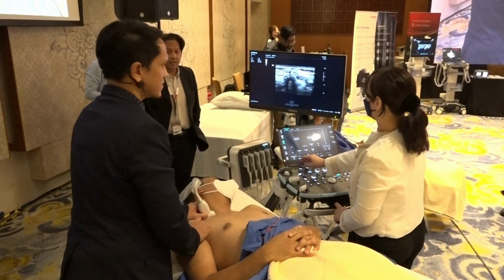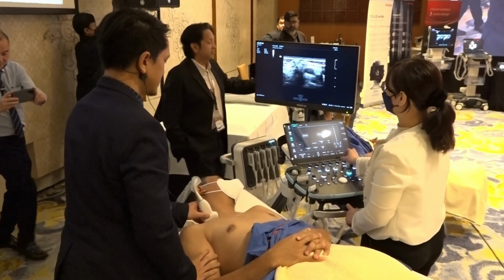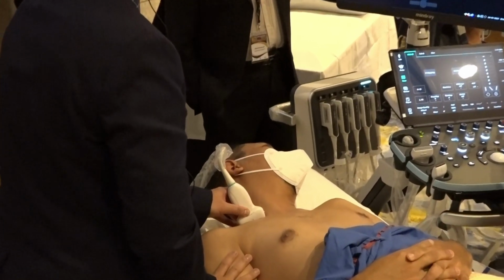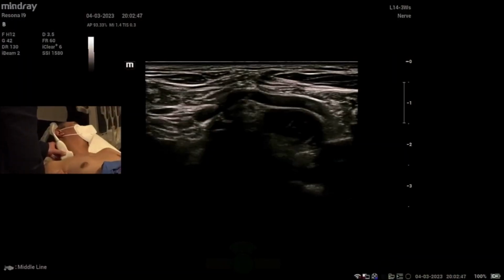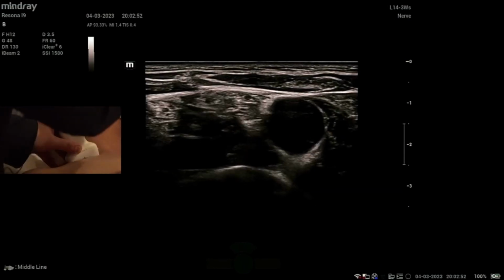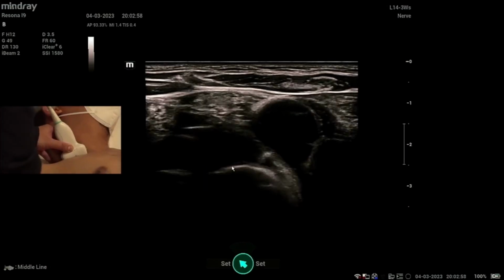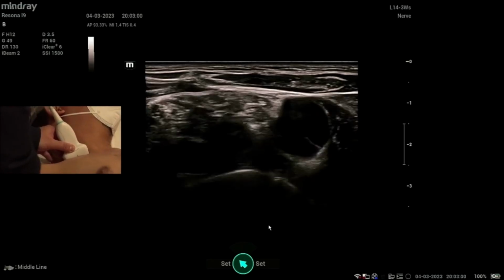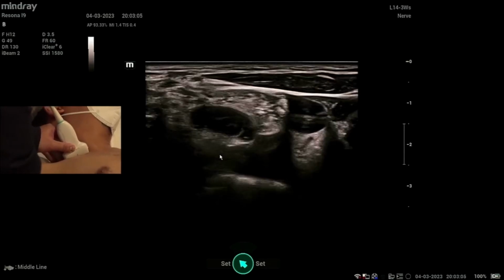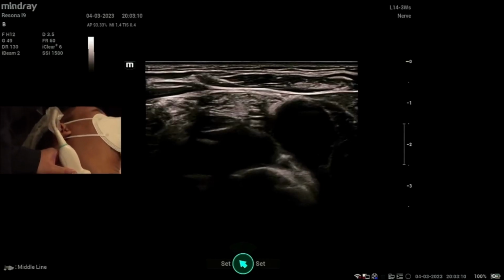Okay, I think everyone can hear me, right? So we're just going to show the basic blocks we already saw just now. The left side of the screen is lateral, the right side of the screen is medial. I'm just going to start from the supraclavicular region. So here you go. Do we have a marker, a pointer? Sure, I'll show for you. I think Jean can show this cursor. Yeah, that's the supraclavicular brachial plexus.